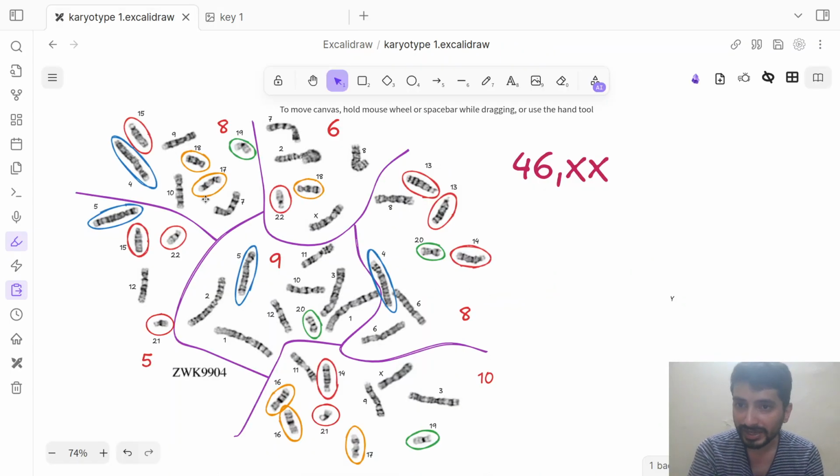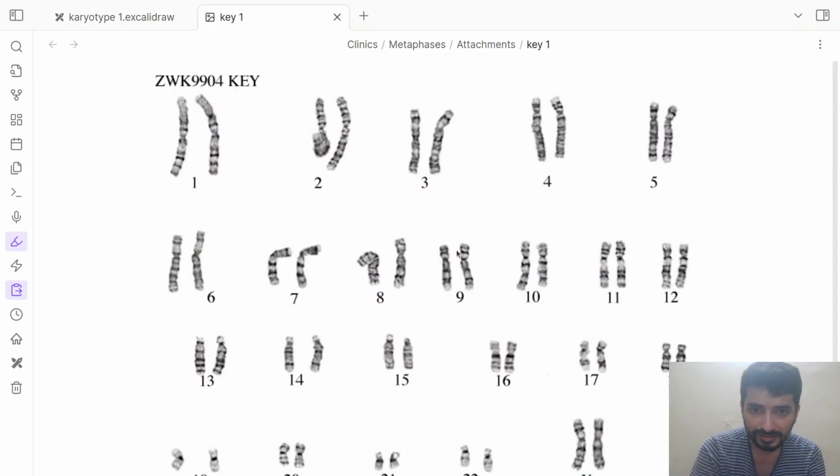So chromosome 9 we had identified over here. So one or two dark bands on the P arm and some dark bands on the Q arm as well. So the other chromosome 9 we had identified it over here. So you can see that both of these chromosomes are identified correctly. Again, the three distinct bands on chromosome 10, and chromosome 11 having a large light region just proximal to the centromere. Again, chromosome 12 very similar, but the light band is much shorter.